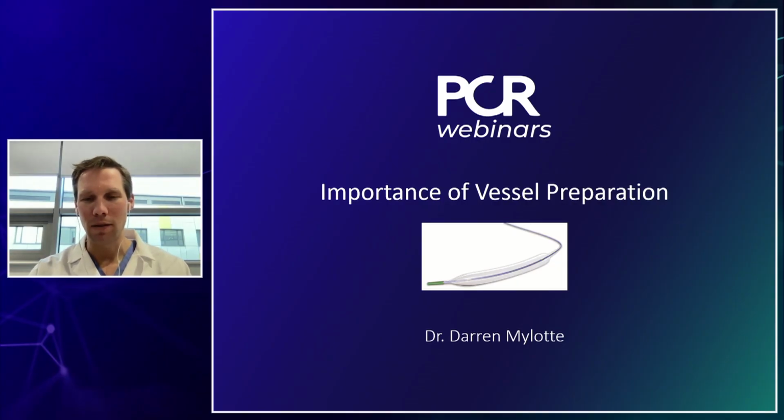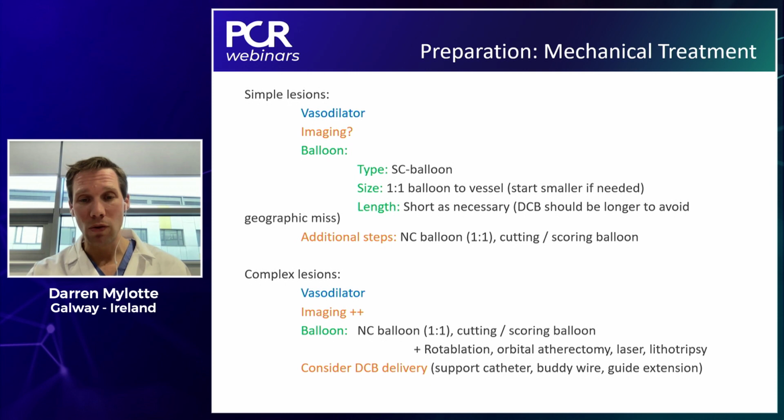So I was asked to discuss, first of all, the importance of vessel preparation. And what I'd like to mention first again is physician preparation. Remember that in EBC main, we learned that you don't have to make a decision to use 2 stents up front. And what I would urge you to consider when you're learning about DCBs and in your clinical practice is that you don't have to define whether you're going to put a stent in upfront. Rather, you can prepare the lesion and then make decisions, stent or balloon.